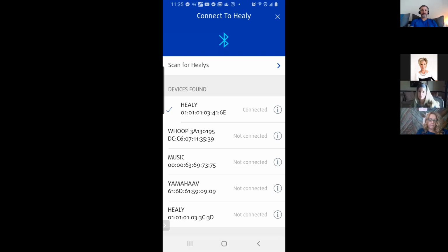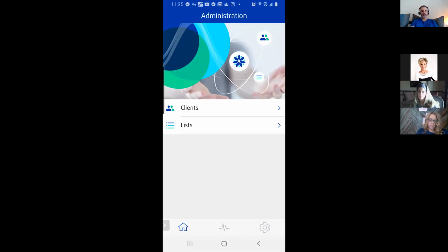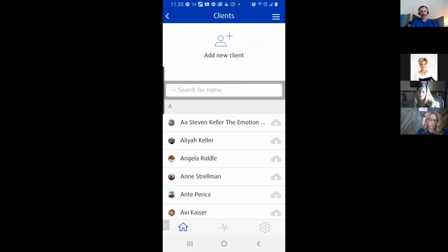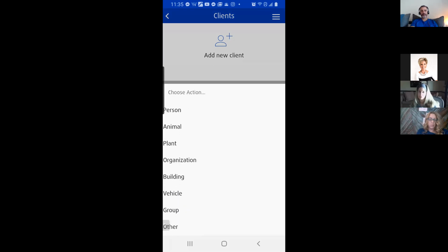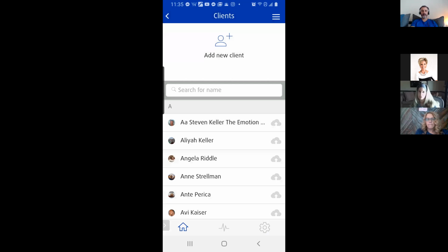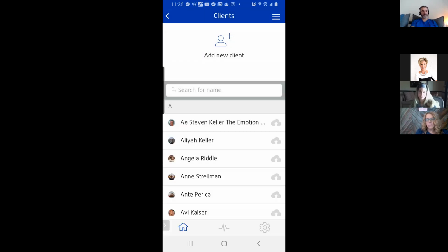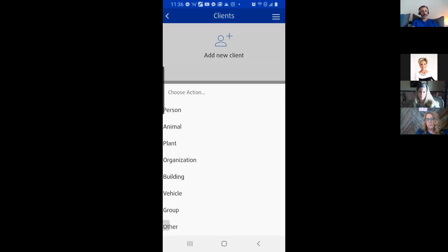So, all right. I know that that is the device, and then I'm going to put the X here, and I know we're connected now. I'm going to go into, first of all, clients, and here's a list of clients. And when I add a new client, one thing to see is I can do a person, animal, plant, organization. By the way, anyone notice that it used to say individual and now it says person? I'm like, oh, interesting. So we go in here: plant, animal, building, group, other, right?